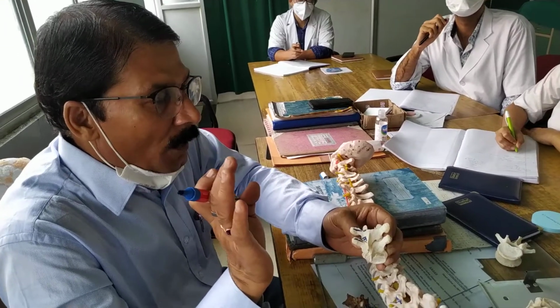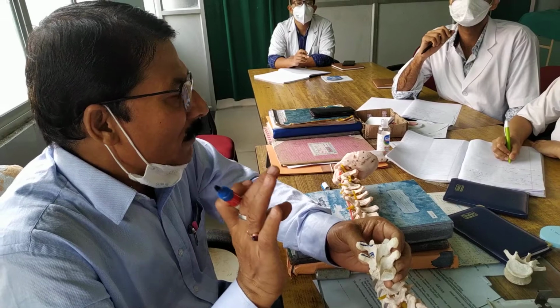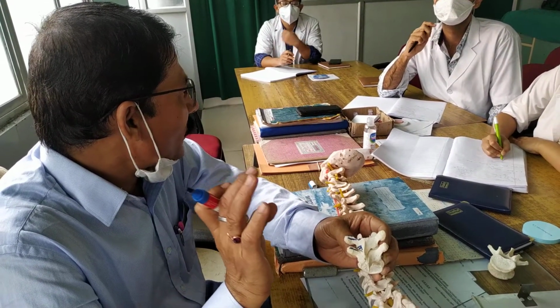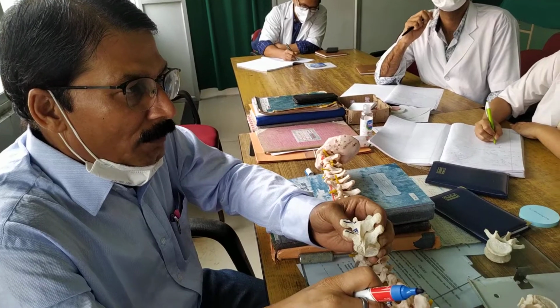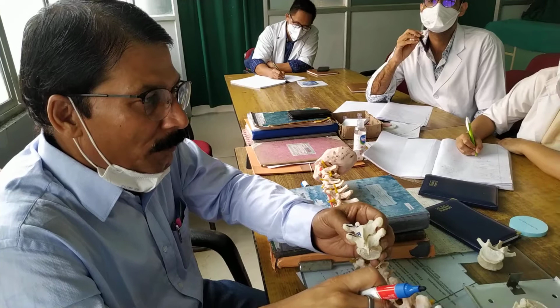This to be clear. There are other point techniques also. We are not going to discuss so many things. You adhere to one point and you have a very clear concept about this, how to find it. Because this is an easy technique, just like your lumbar one we have already discussed. The midline of the transverse process is important.